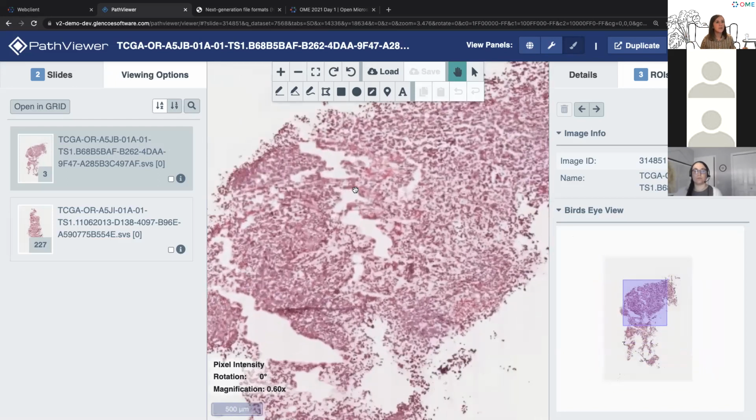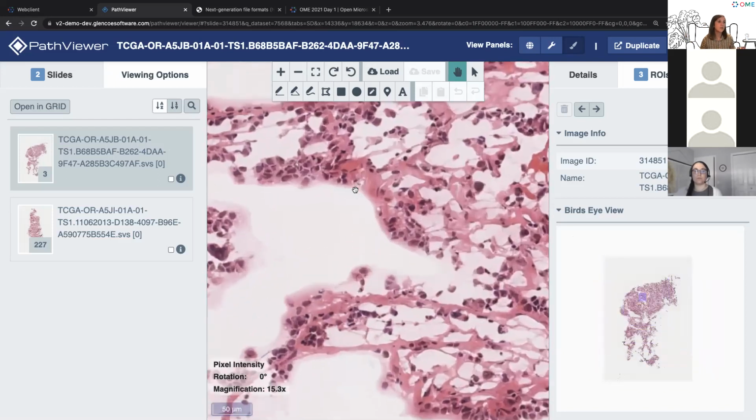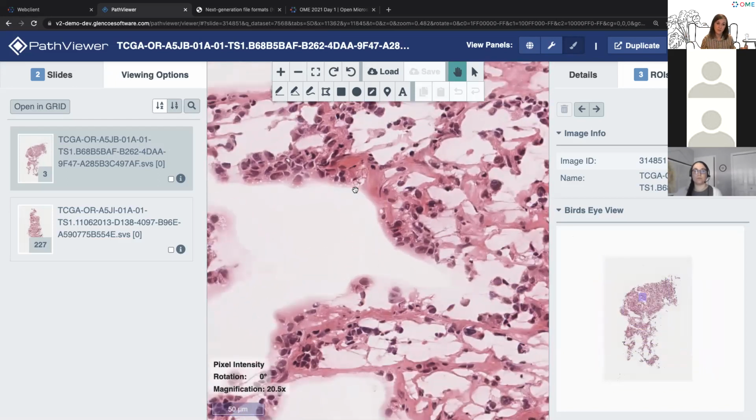But as I zoom in, I want to maybe look at the highest resolution data now, but I only have to look at maybe 1 or 2 neighboring tiles in order to get this particular view, because I'm spatially restricted in X and Y. I don't need to look at this tile down here in the bottom right-hand corner because it's not in view currently. Okay, and I'm emphasizing that because, as I said, it'll come up again when we think about how to represent the segmentation of this original image data.